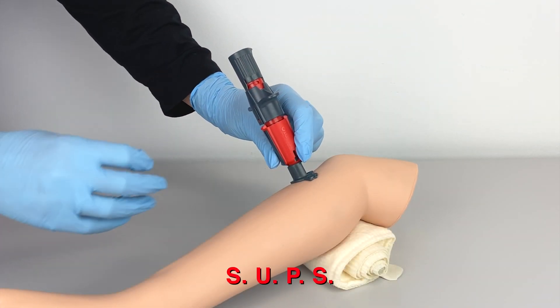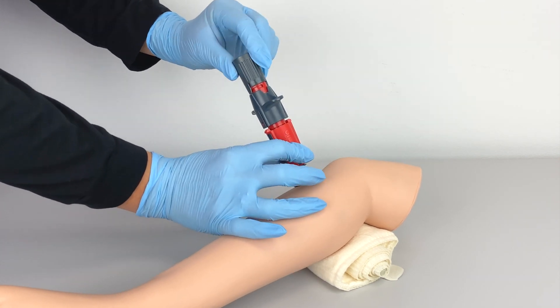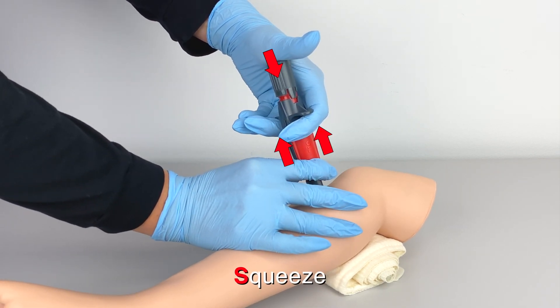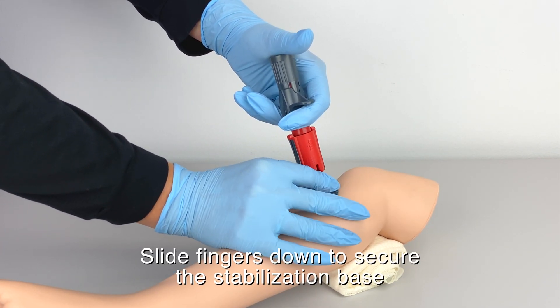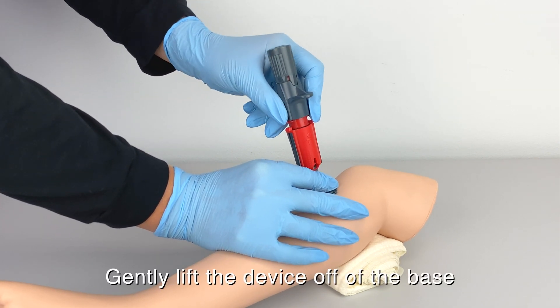I'm going to follow the SUPS — stabilize, unlock, press — and as I press, I'm gently going to squeeze the trigger wings to deploy the device. Once I've deployed the device, I'm going to slide my fingers down to the stabilization base to stabilize the device and then gently pull off.